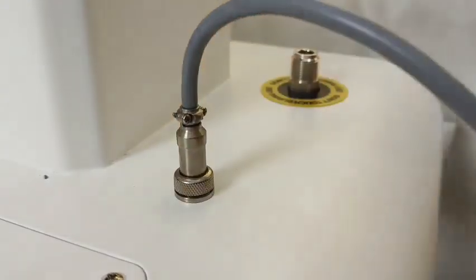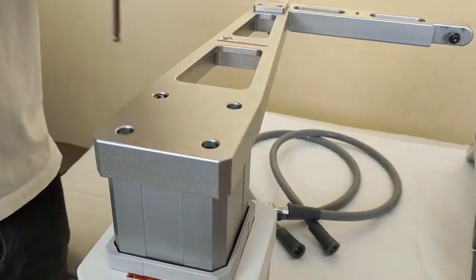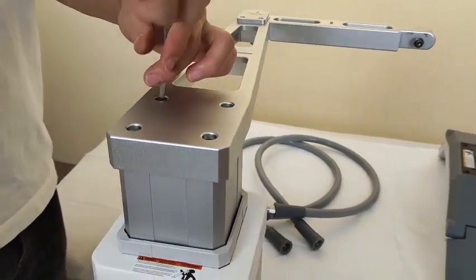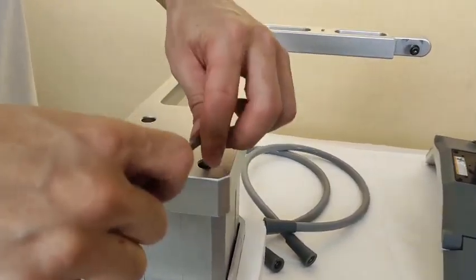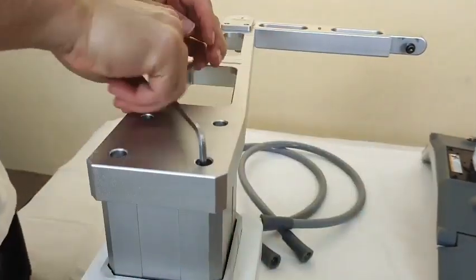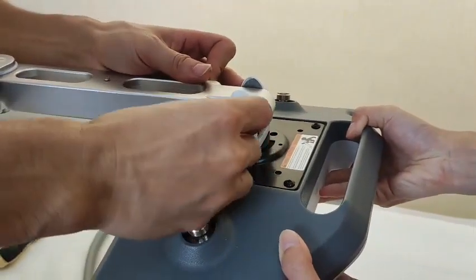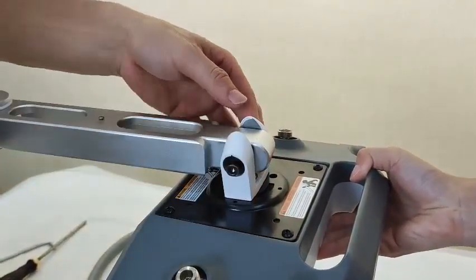Match the hole and then tie it. Next step, we will install the shelf and put this shelf on the machine, then match these four holes and use the screw to tie it. Then we will put this paddle on the shelf and use the big screws to tie it.